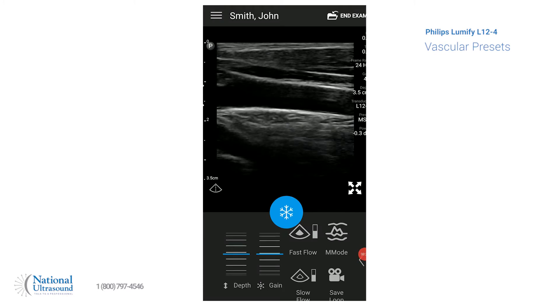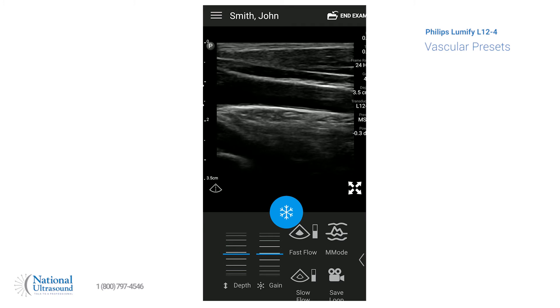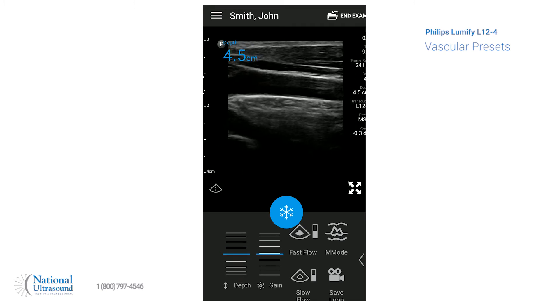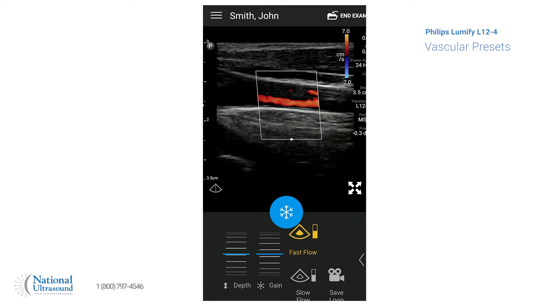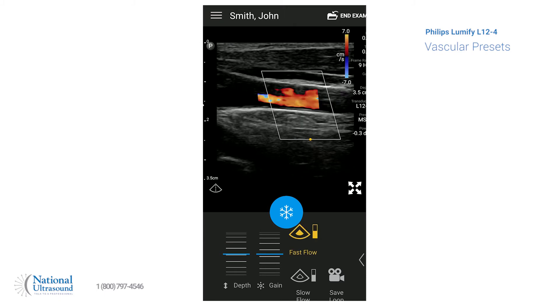We already have our patient information in, and we're on the carotid artery. Over here on the left, you can adjust the depth if you need it, and you can adjust the gain of the 2D screen. Then you can add color — there's the fast flow or the slow flow. We'll go on fast, and you can adjust the steering and move it where you need to.